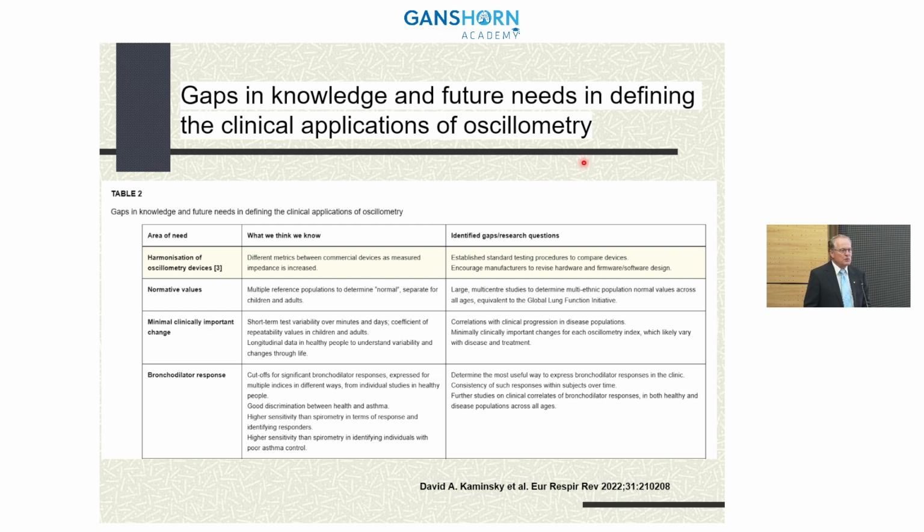Just like in spirometry, you can have a plethora of divisions of mathematical computations related to how we blow the air out, but we focus in on forced vital capacity and FEV1 and the ratio as the primary values required to interpret a spirometry value.